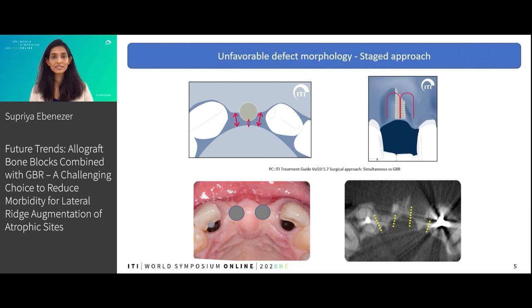With our patient here, we see that the defect morphology is not favorable and the crest width is minimal. Hence, we would not be able to place an implant in the correct position. Hence, we choose a staged approach.